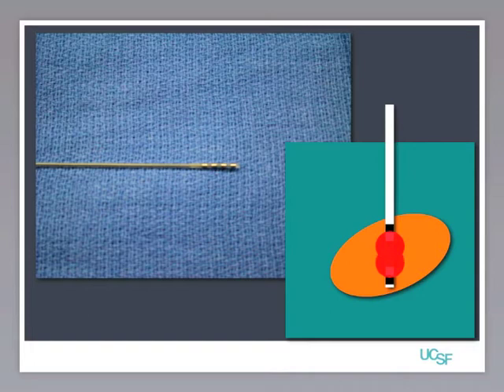We can also turn the stimulation up and down. So if we have the stimulation at a certain level, we're stimulating this much, but if we turn it up, we're stimulating more. And very attractively, if we get a side effect or we have an unwanted effect, if we turn the device off, it's like it's not even there. So this is a way of adjustably and reversibly altering brain function to try to improve symptoms of Parkinson's disease.